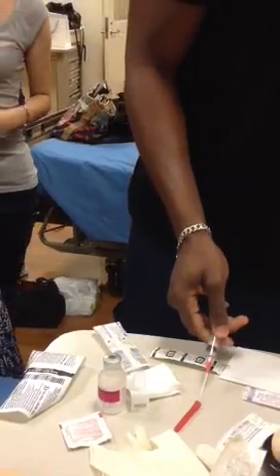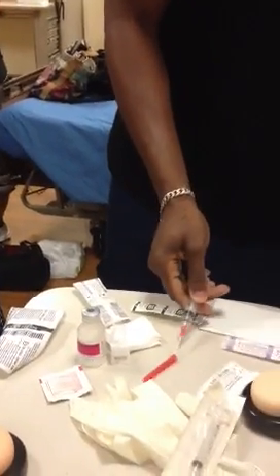Okay, so now I'm going to pick that back up. My hand's shaking. I'm nervous. At this point, I'm going to recheck with the order so that I've got the right amount, which is 1 mil. So how many times has he checked? This is the second time. This is a third, isn't it? Third time. So that's how many times you're supposed to check, right?